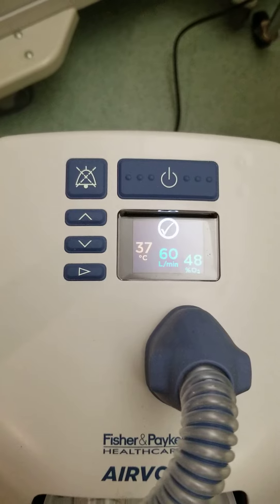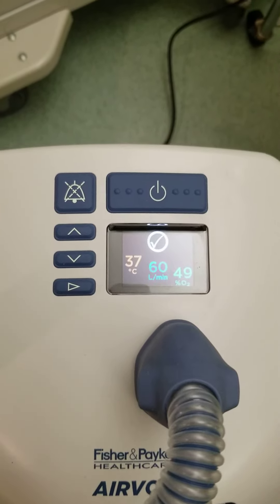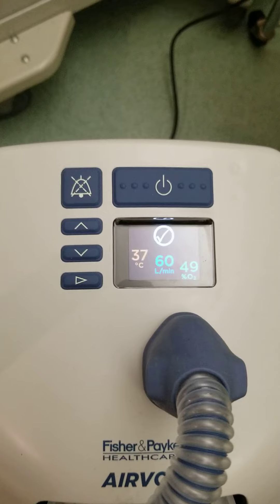If you need a higher FiO2 but don't need all that volume, you can just titrate down to say 40 liters per minute.